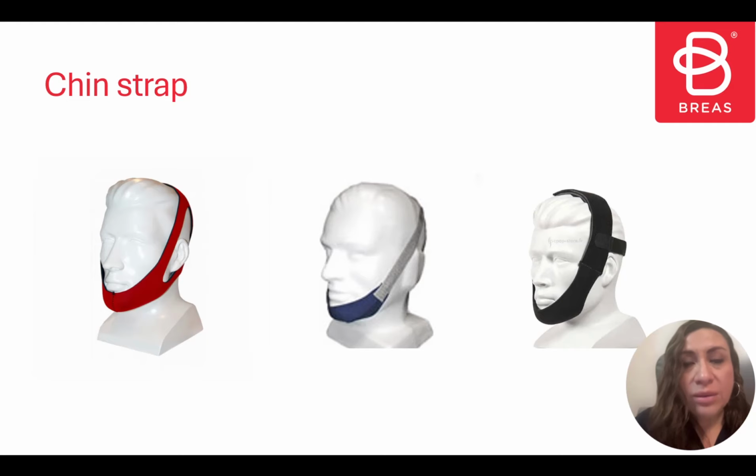An interesting element to keep in mind is the chin strap. In fact, the chin strap will prevent the mouth from opening during use, whether with a nasal mask, or sometimes you are forced to put on a mouth mask, that is to say a face mask, and put on the chin strap to avoid mouth opening.